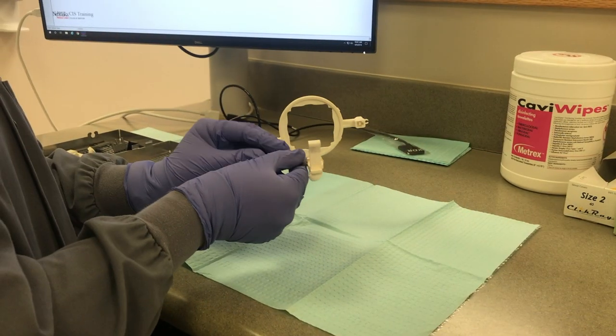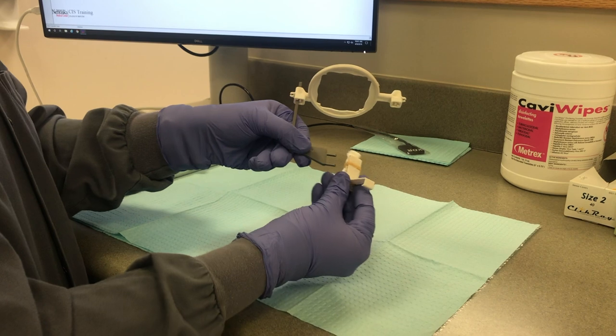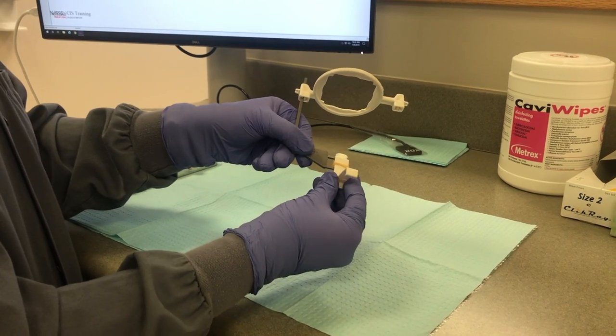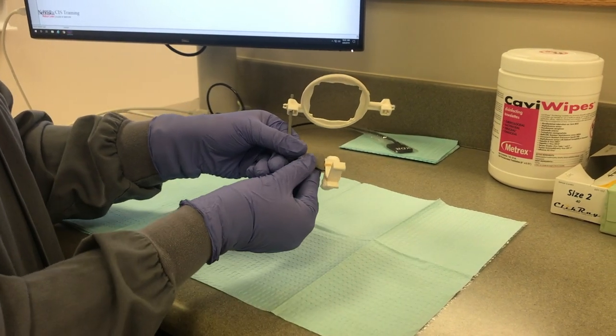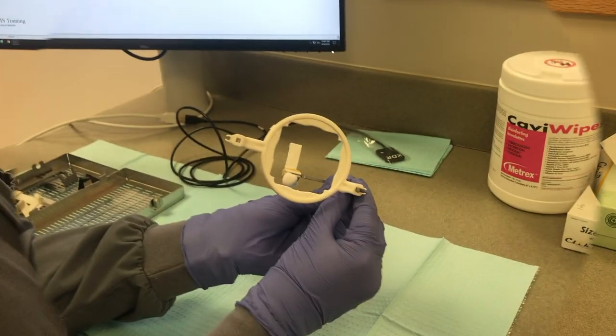For a right maxillary posterior periapical, place the two prongs of the indicator arm into the opening of the posterior bite block. Put the sensor horizontally into the bite block. Center the aiming ring over the sensor.